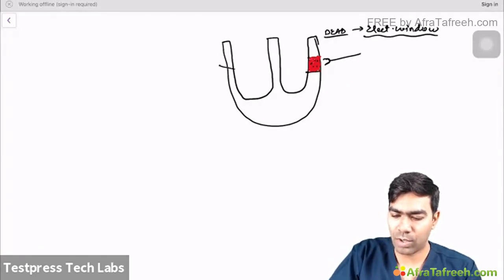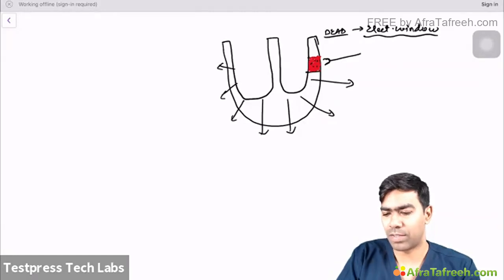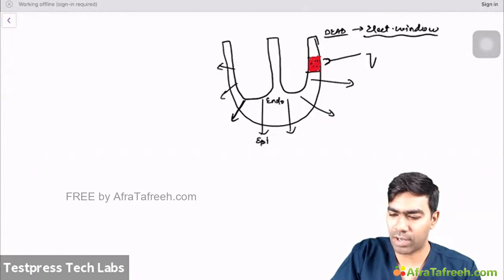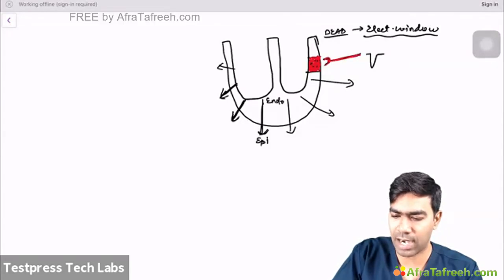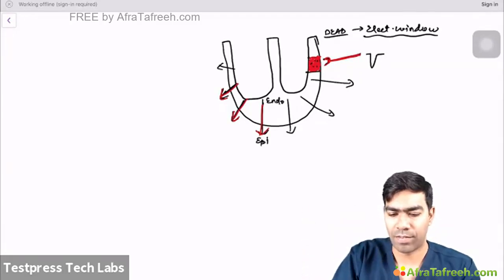So now on the other side, you know the depolarizations are going to happen in this direction, which means depolarizations are going to move from endocardium to epicardium. We know that. So because depolarizations are moving in the opposite direction, from endocardium to epicardium, you will really know that this will create a negative deflection here, because the currents are always moving away from this lead's perspective. You see this lead as a standard, and if you see what's happening in the other areas, the current is actually moving away from this particular lead. So they're going to create a negative deflection, and that is what we refer to as a pathological Q wave.